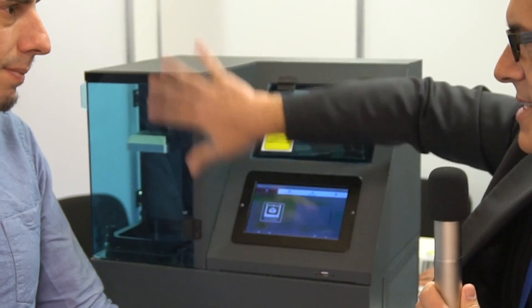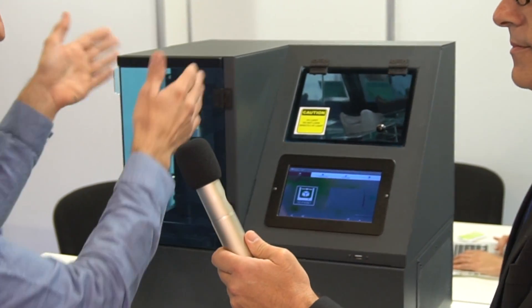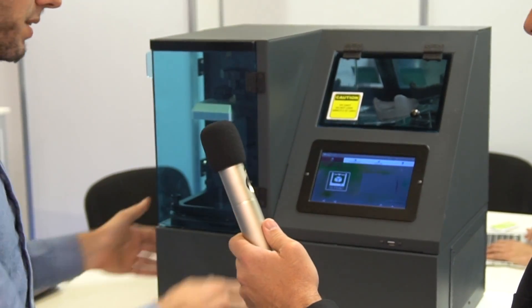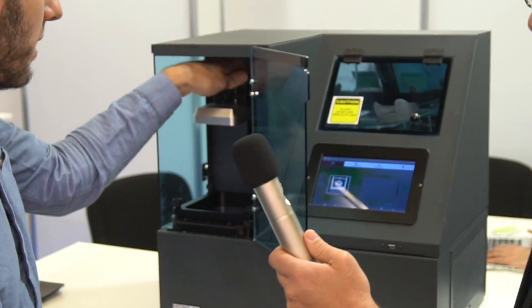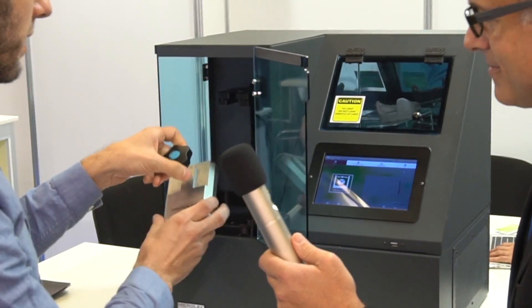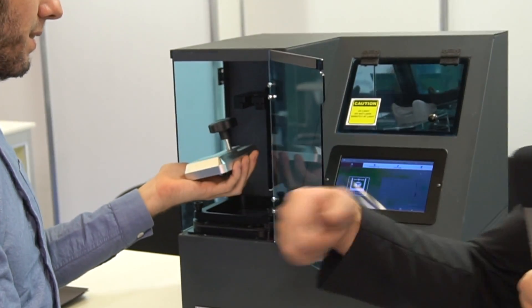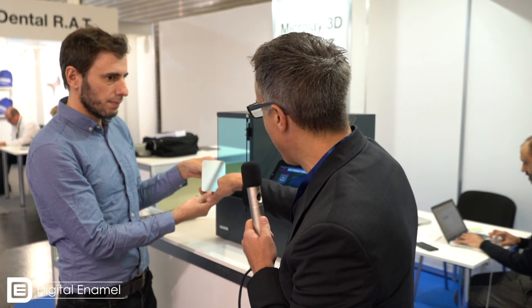Gene, tell us a little bit about what this is and what this does. Well, this is the real printer — this is where things happen. We have this aluminum plate, which I think is beautiful. Yes, it's very nice. This is the build platform. So if you flip that over for the camera — this is where the print gets stuck to when you're done, and it's built up out of this vat of resin down there.